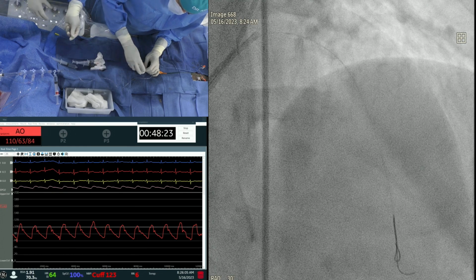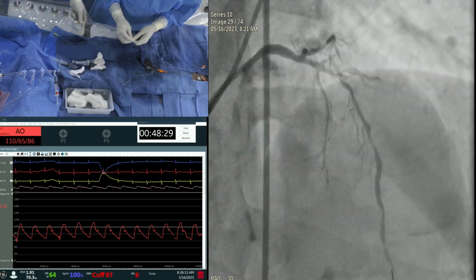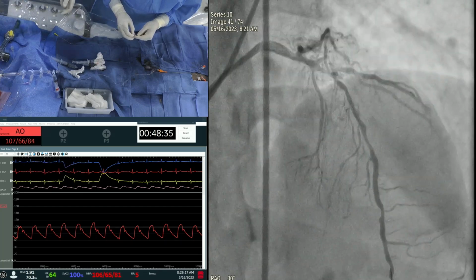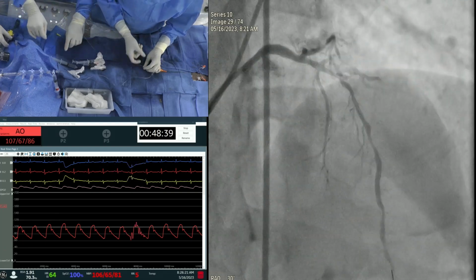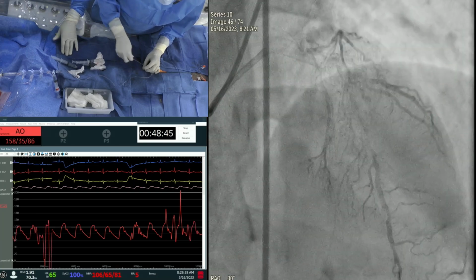Good. There is significant disease in the plaque just before that, not allowing the movement of the wire. So I think we need to dilate it, and then the direction of the plaque takes the wire. The question is, do you want to put one stent distally? Because we're going to put two stents here. Okay, give us a 3.0 by 32 Promus. Then you have a double wire there. No, at that time we just pull back.